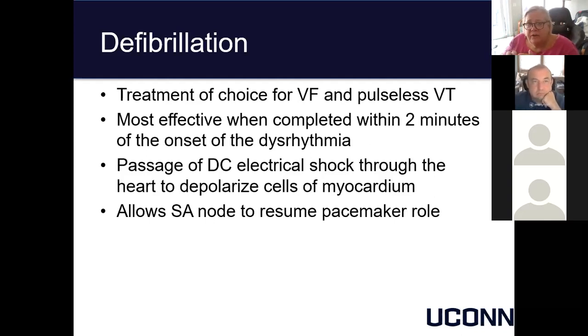By cardioverting, you're syncing the shock to the patient's EKG. So it's almost two parts. You hook them up to the defibrillator machine, which monitors the heart rate and electrical activity, and it's going to time the shock so as to reorganize the rhythm, but not at a time where it will potentially make it worse.